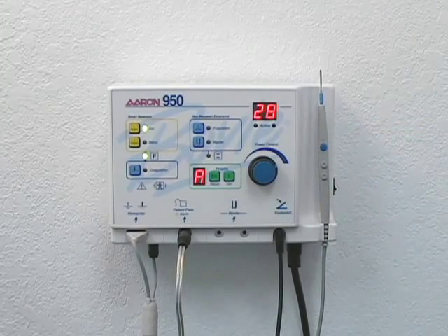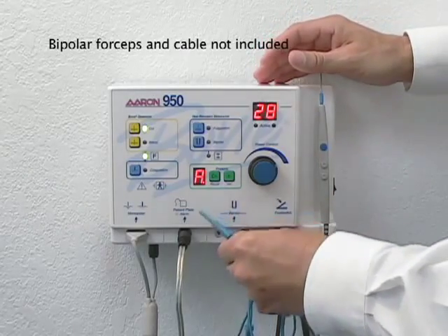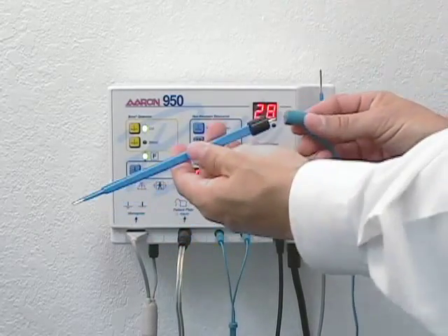In order to use the bipolar mode, bipolar forceps must be connected. To attach the optional bipolar cable, insert the connectors into the receptacle marked bipolar. To connect the optional bipolar forceps, insert the prongs into the plug.